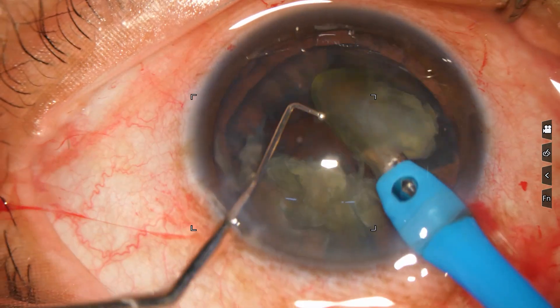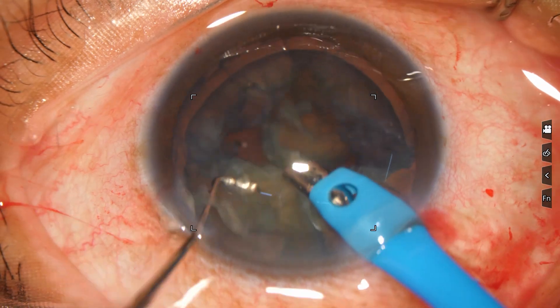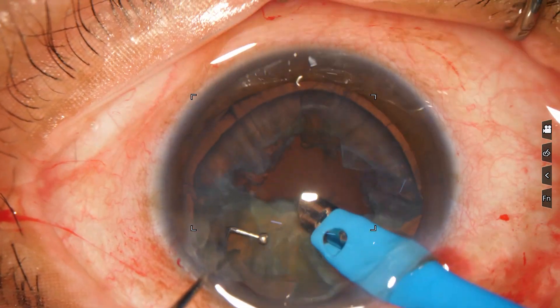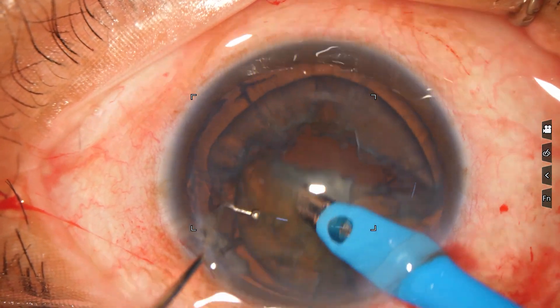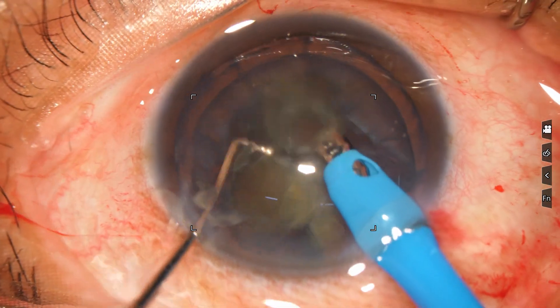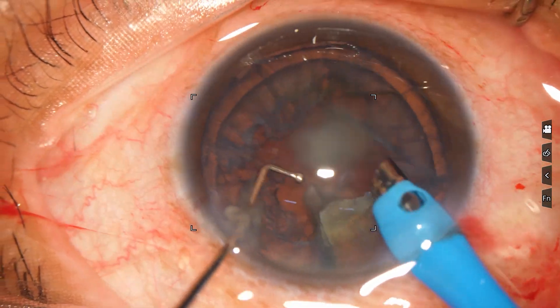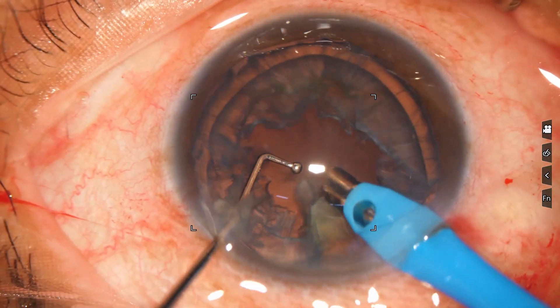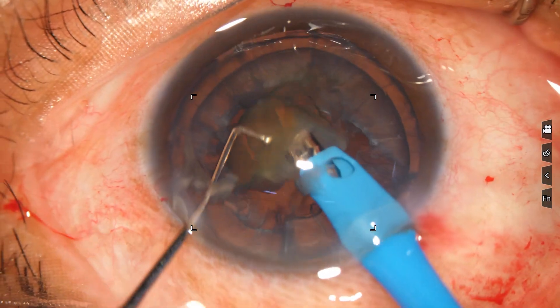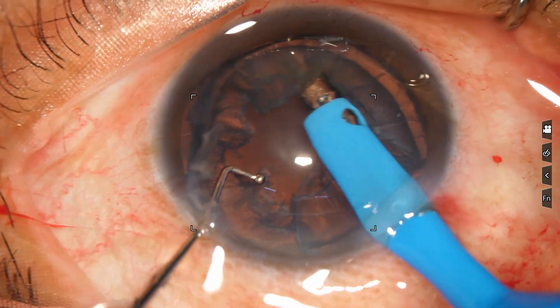Phaco will emulsify the nuclear pieces. This is another piece. The ultrasonic energy used at this time is 60 to 70 percent. Flow rate is 45 ml per minute. Vacuum is 450 mmHg.